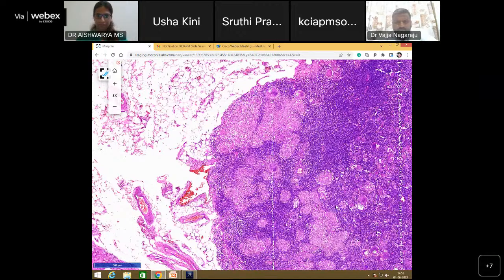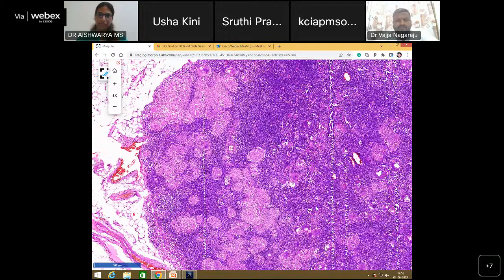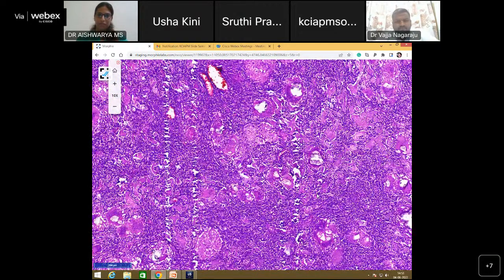If there's anything the others would like to add, Harshita, Gina, Ankita, are there any eosinophils? Can these be foreign bodies or any parasites or anything else, because they don't look normal? Is there any tissue response to these?